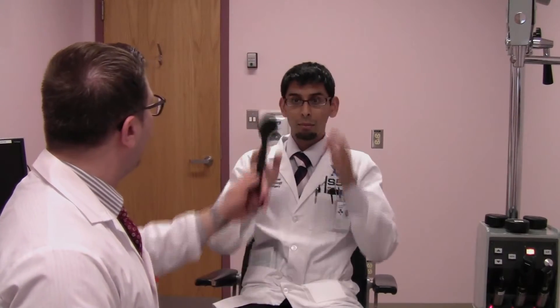He says he can't see at all. A second pitfall: you want to make sure to ask the patient if they wear corrective lenses or not. Do you wear corrective glasses? He says yes, he has his spectacles right here. Please put them on. Now cover your left eye for me. By convention, we usually start by testing the patient's right eye, so I have them cover their left eye with the occluder. Can you please read the letter on the screen? That's an E. Excellent.